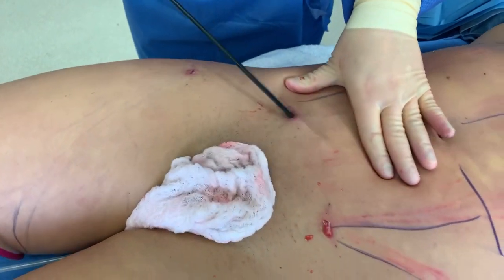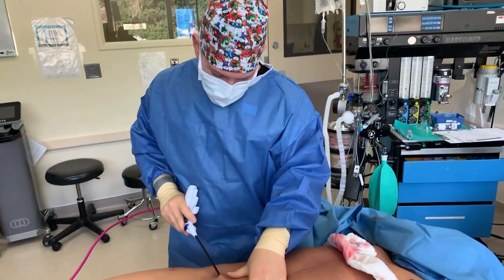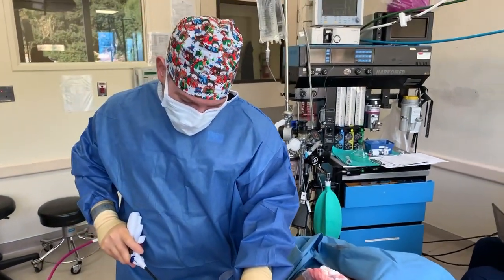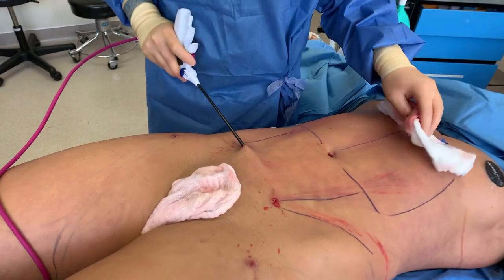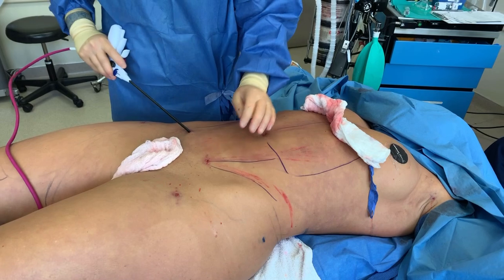They're asking if we're planning on transferring the fat — we are. We're going to put it to her butt today, just a little. She doesn't want to look overly large, she just wants a little sort of shape. We're going to give her that emerald hourglass look.